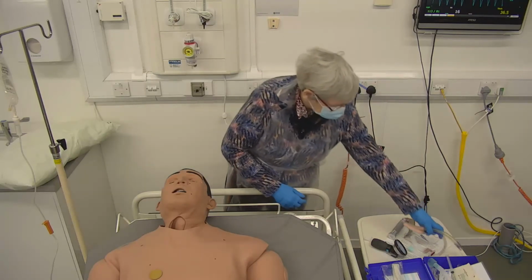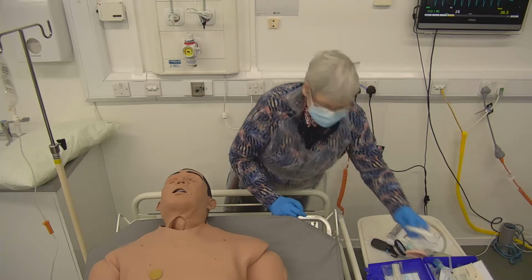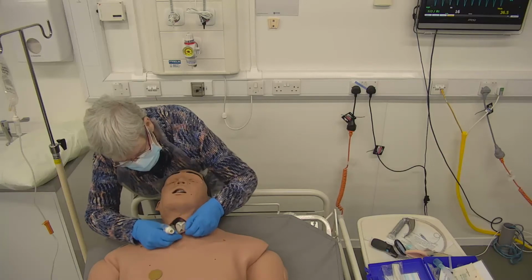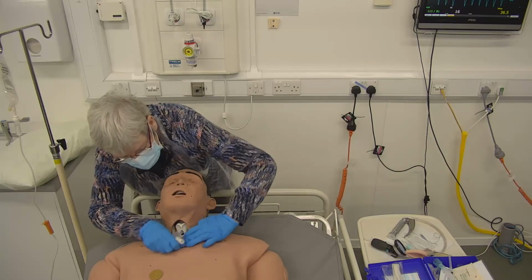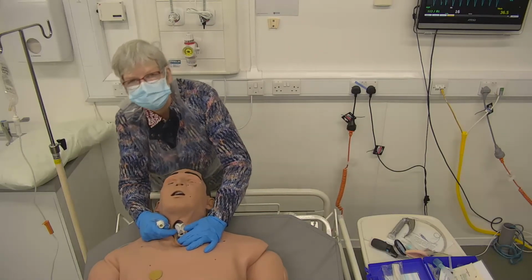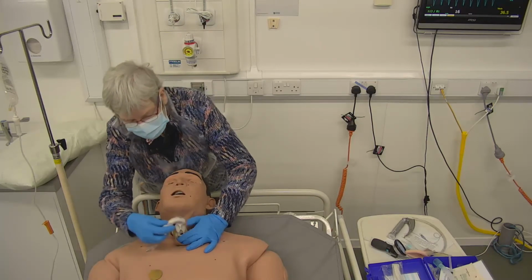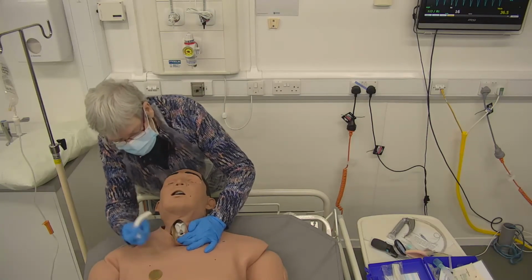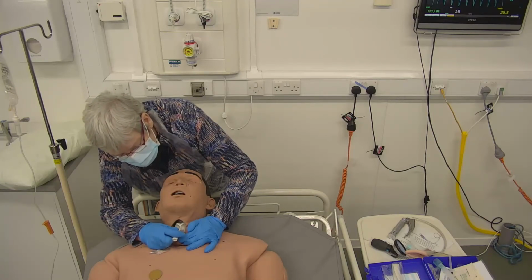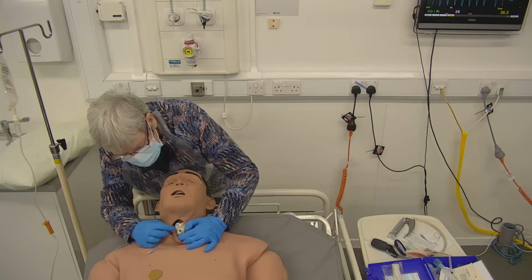But now we're thinking about a tracheostomy. So what we do for this is a hole is made in the throat, and actually Metiman's got this amazing little hole already here. You can imagine that this is the cricoid cartilage, and here is my trachea. So what they do is they make a hole in the skin and then just slide this through the skin and through between the cartilage to go down and into the airways.